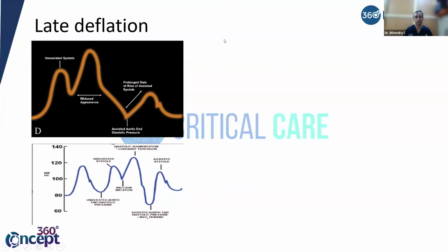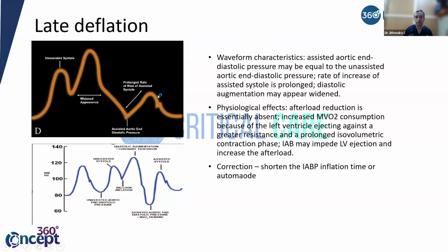So this is late deflation. You can see very late it is getting deflated. I mean, it is easy. So obviously there are only 4 errors in timing, and I finished 3 of them. So it is easy. But in the exam, you should appreciate the waveform. Only then will you come to know. You will not be having a normal waveform there. You will only have this waveform and you will be having 1:2 augmentation. So you should see what is happening here.